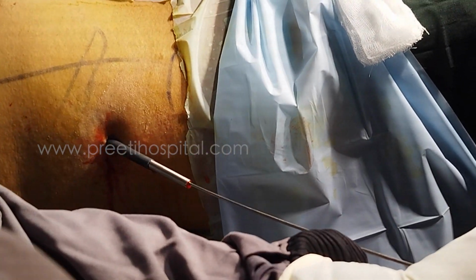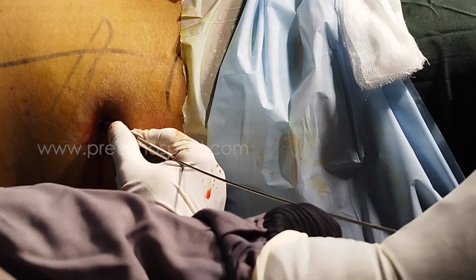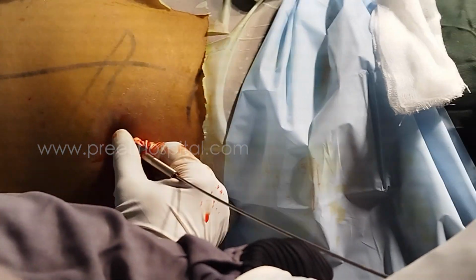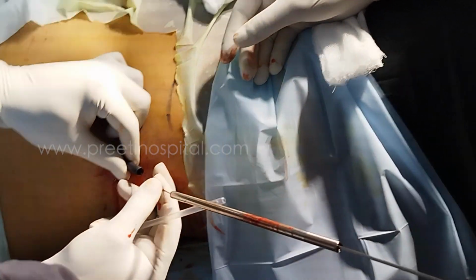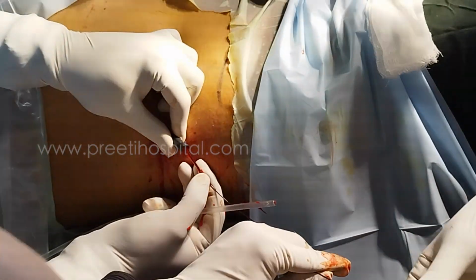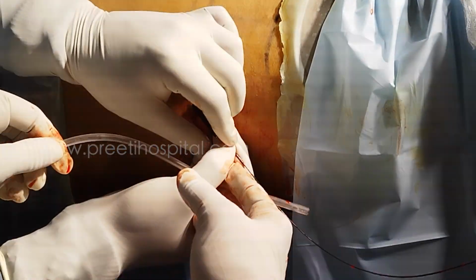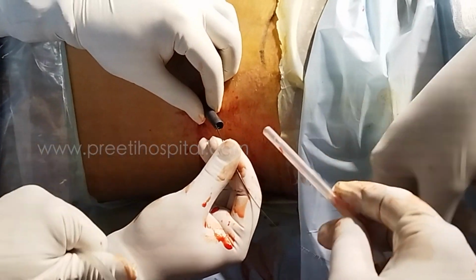Now can you switch on the camera? Water is coming. You should infuse more water and it should be clear. Water from below, please. I am telling you only water. That's not your job, sister's job. You should give water infusion. Now this guide wire usually slips. Immediately hold it. Now water, please.